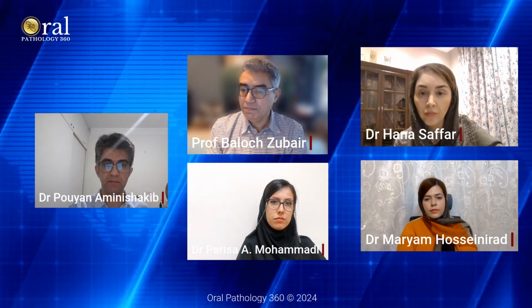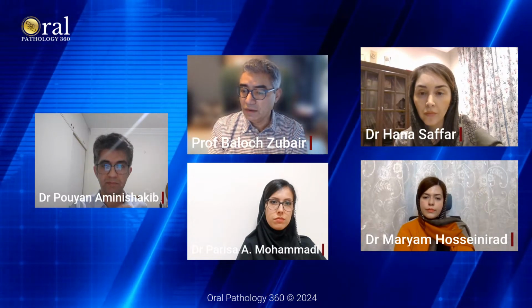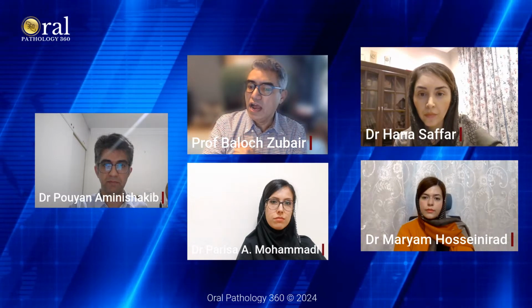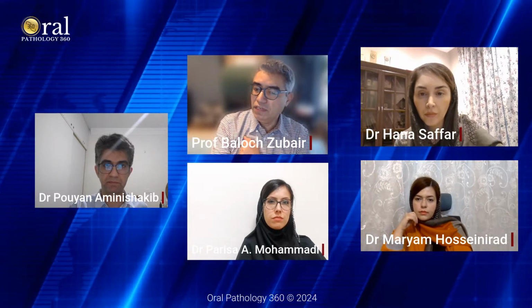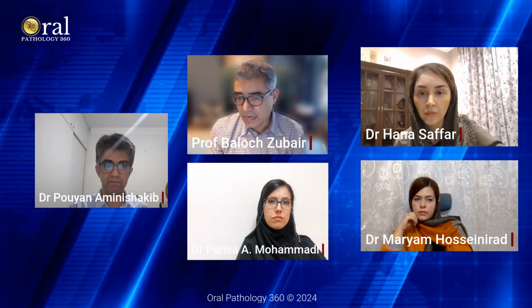I will do a P40 and CK5/6 stain on this, and we'll do a mucicarmine stain, a very special stain. I'll do it to make sure how much intracytoplasmic mucin I'm really seeing. If there is a really good amount, then I will lean my diagnosis towards mucoepidermoid carcinoma. And I'm very honest with them sometimes.